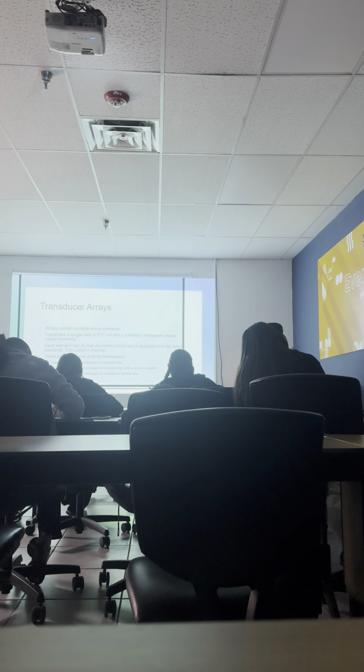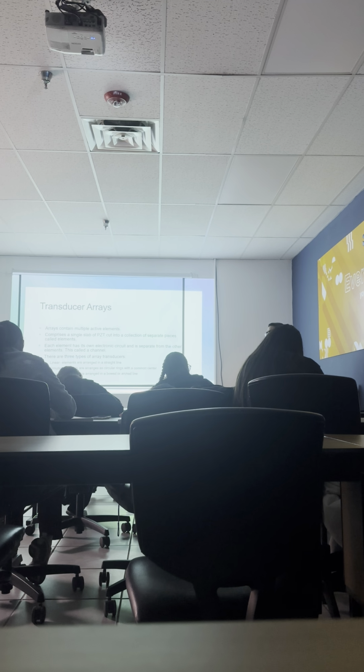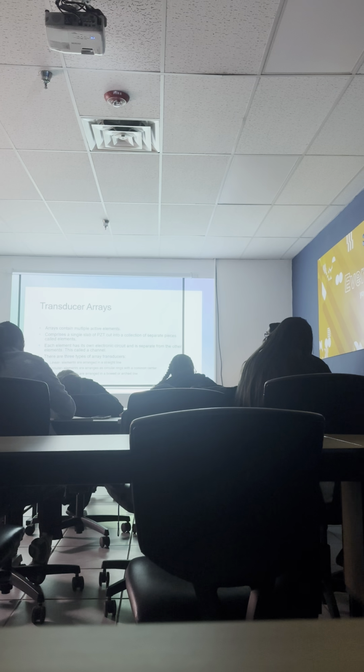It's composed of a single slab of PZT cut into a collection of several pieces called elements. They formed this crystal, then cut that crystal into smaller individual elements. Each element has its own electronic circuit and is separate from the other elements. This is called a channel.